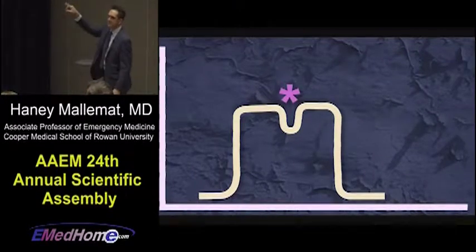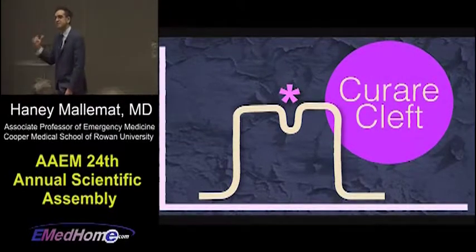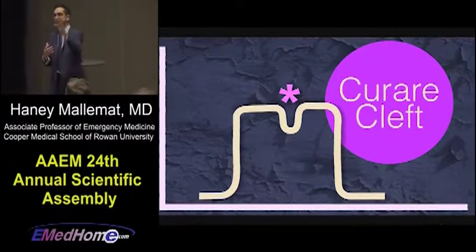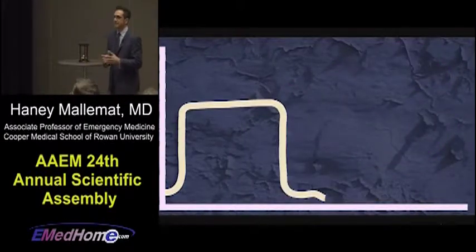Look at this one. We have that little dip in the top. This is called a curare cleft. This is happening in a patient who's intubated and starts to wake up and takes a breath in during the expiratory phase. They need more sedation. They need more analgesia.